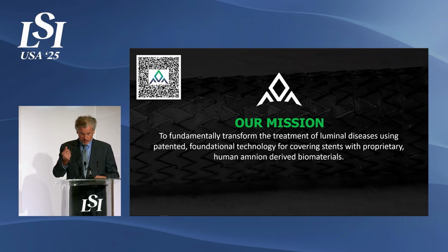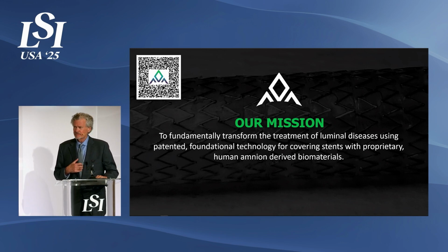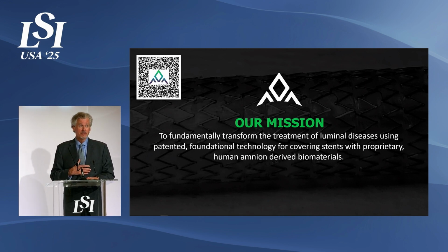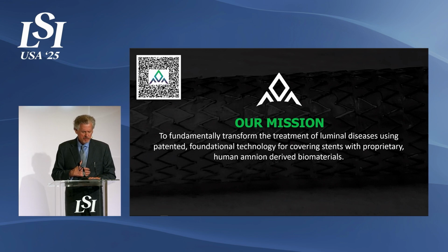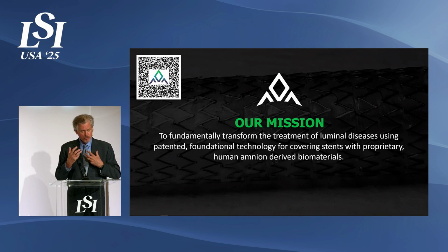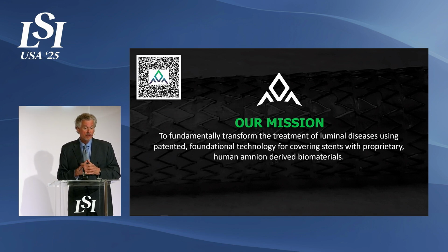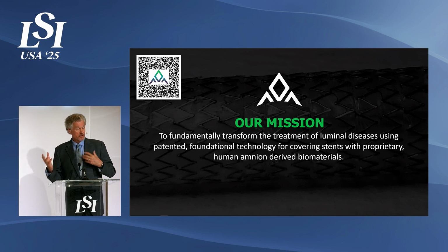One of the issues that you highlighted earlier, Bill, was the issue with any implants at all. They become challenged. There's something called foreign body response or rejection, and it happens to just about every device that's implanted, and certainly stents are not exempt from it. But a significant portion of the body is made up of tubes, right? Lumens. And they have a tendency to either close down or open up, like an aneurysm. And our goal is to open that which is closed and close that which is open.